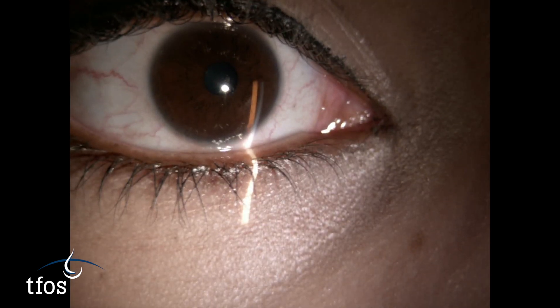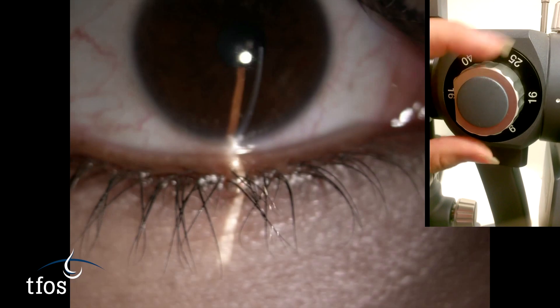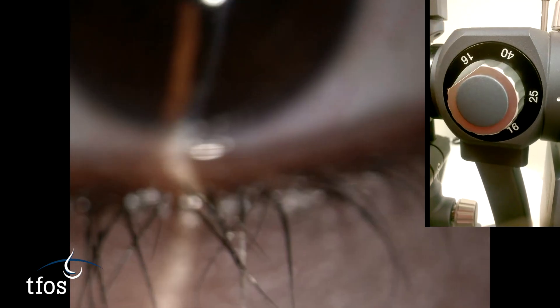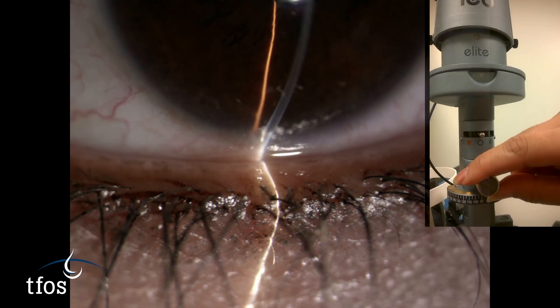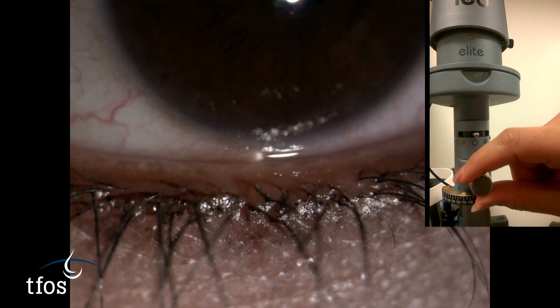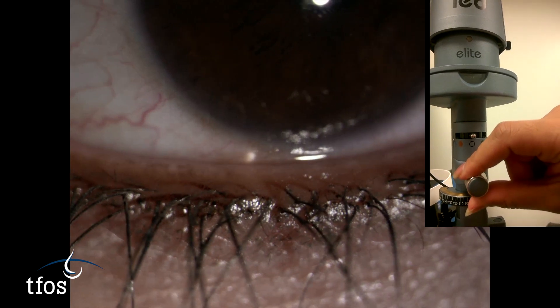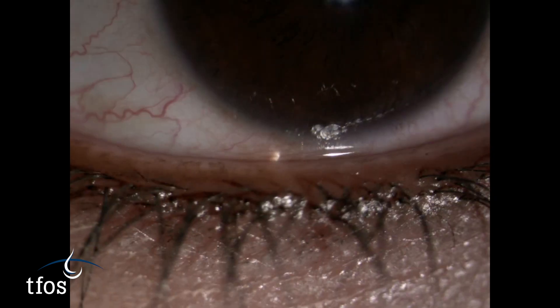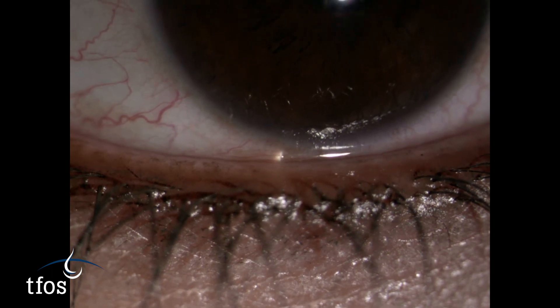Adjust the height of the slit beam to its smallest setting, typically around 0.3 mm, as this will be used as a comparator. This is done as the slit lamp beam width is rarely well calibrated. Note this method provides an estimation of the tear meniscus height rather than an accurate quantification.